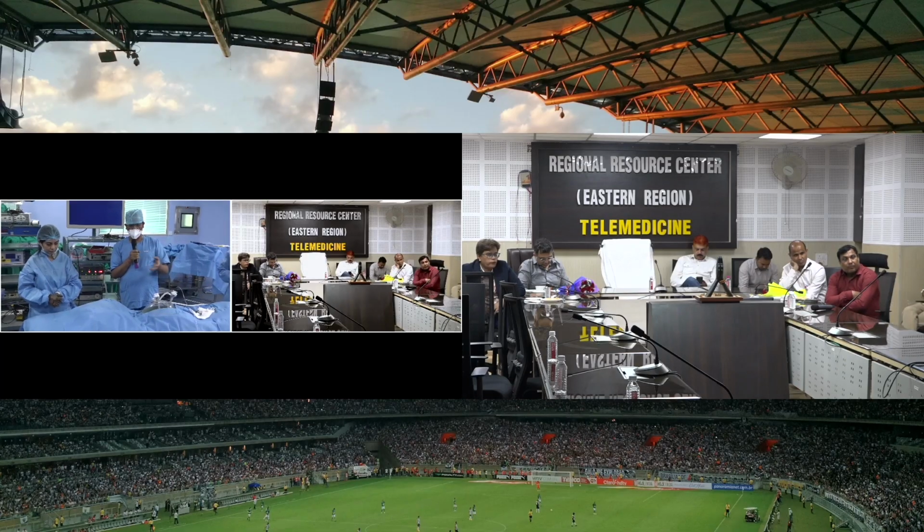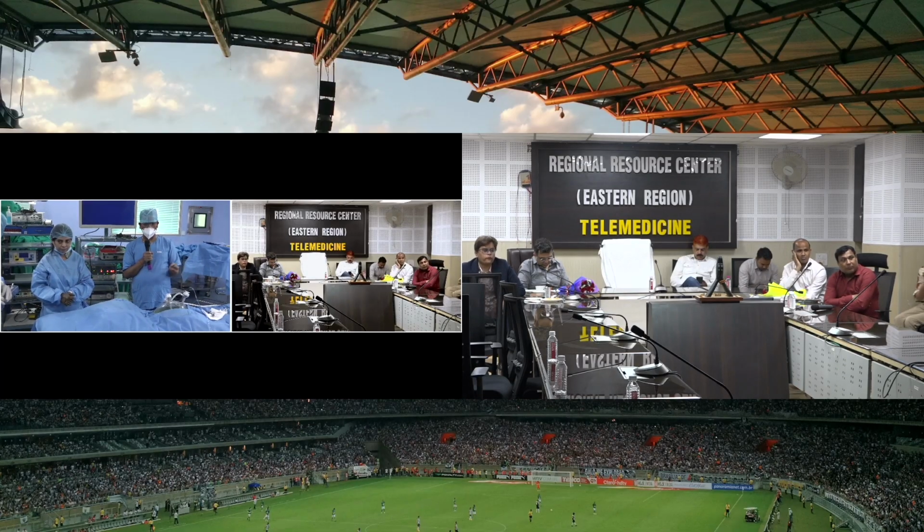Yeah, because through the same port you can take the biopsy, only from a different quadrant. It's easy to take the biopsy of this. The telescope is already there, and through one port you can just take the biopsy. So that's an easier job. That is not a big thing.